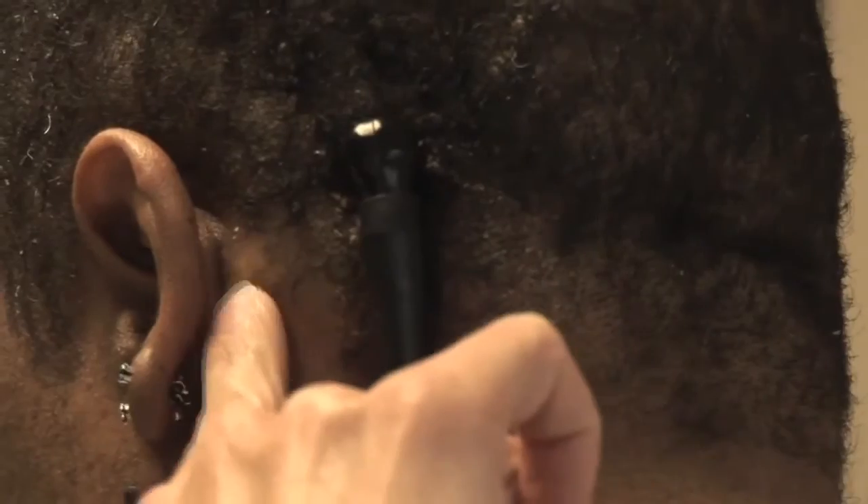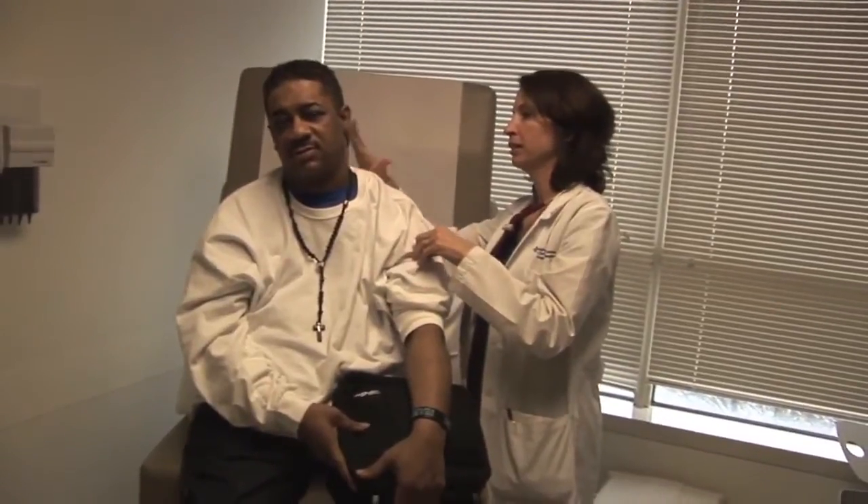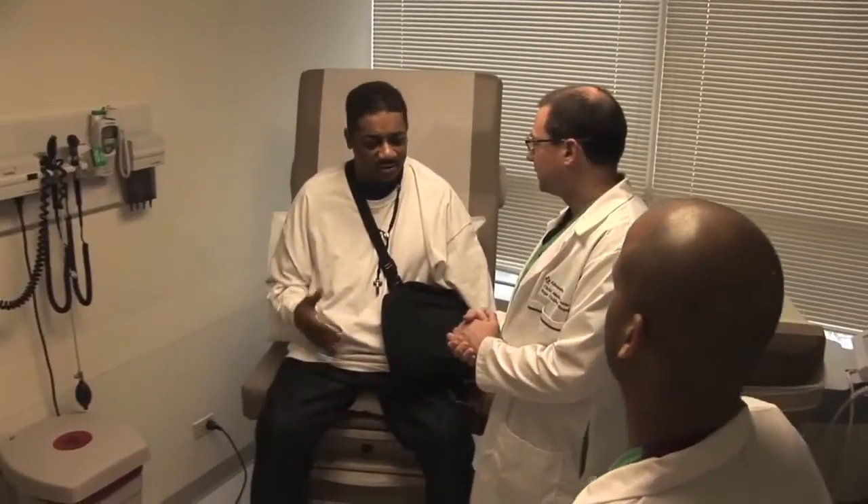The advantage of this electrical cable is that it's tunneled through the chest, up the neck, and placed behind the ear. There's a series of holes on it, and we physically screw it into part of the skull, so it's fixed very securely and doesn't move. The skull and the skin around it have a rich blood supply, and because of that, we believe the propensity for infection may be less. This pump is still investigational — it's part of an FDA study, as is the technique of this driveline implantation, so we don't know with certainty. Mr. Brooks is part of that evaluation.